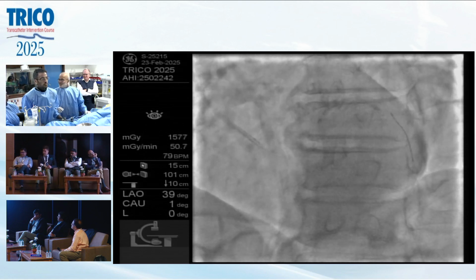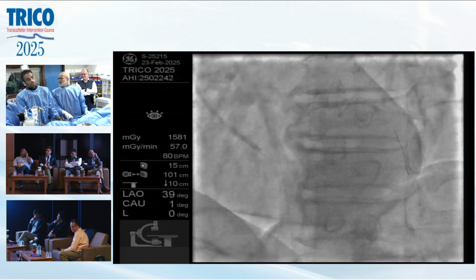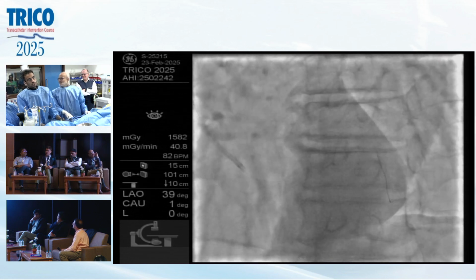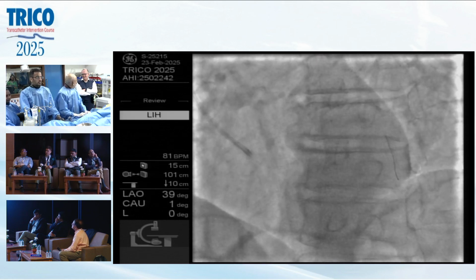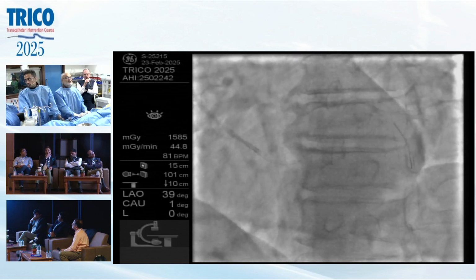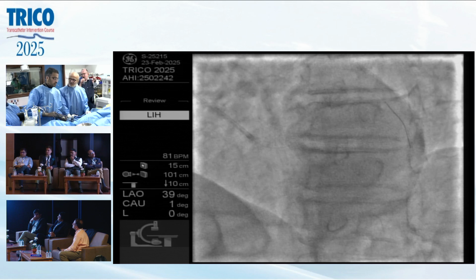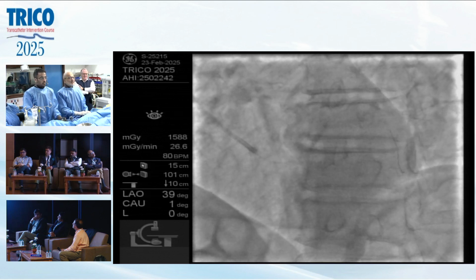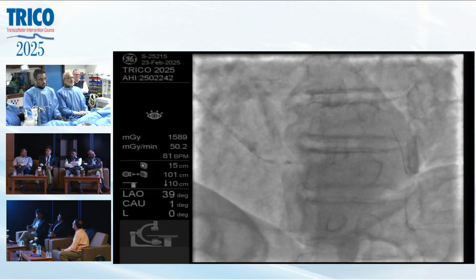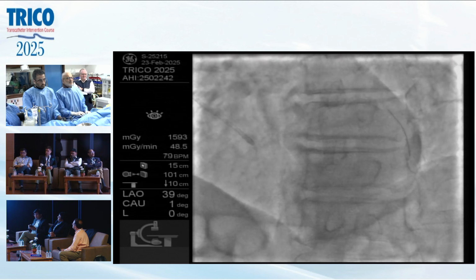StentWiz. Yeah, that is again the same thing. Okay, only during the time of deployment. No, you can use it even with this. I think you can use. I'm not familiar with the GE system, but I think you can still use it here for your enhancement. Deflate. Check it.